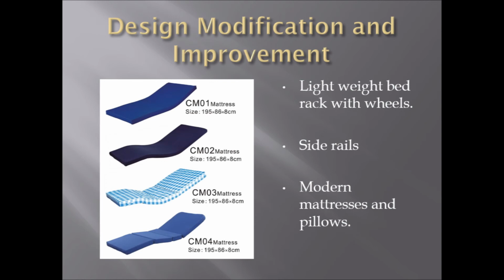Usually, the hospital bed is needed to send the patient to the operation room and other medical checkups. Wheels enable easier movement of the bed either within part of the facility they are located or within the room. Sometimes, movement of the bed a few inches to a few feet may be necessary in patient care. Wheels of the modern hospital bed are lockable. For safety, the wheels can be locked when transferring the patient in or out of the bed.